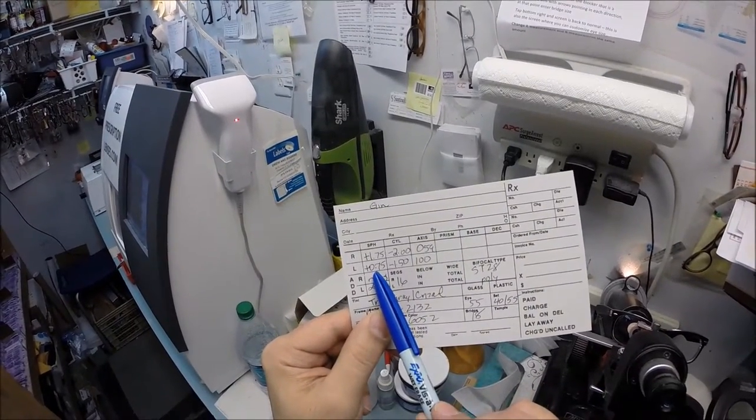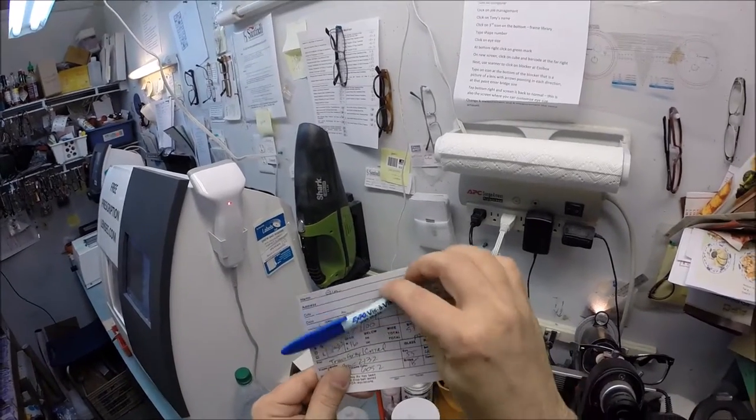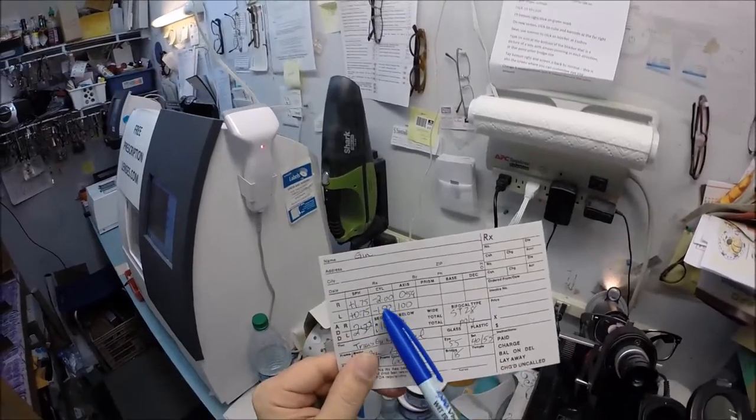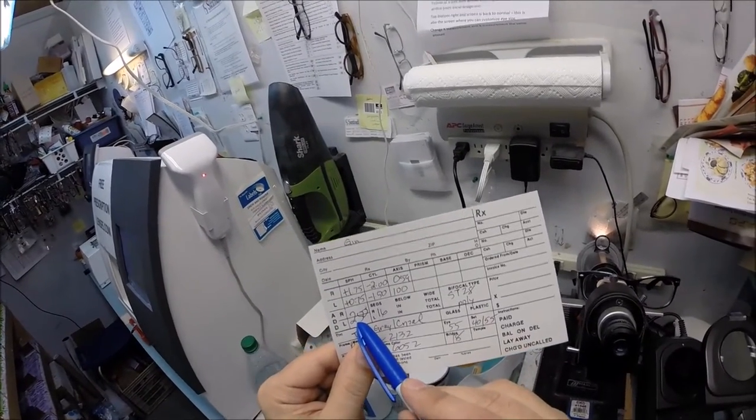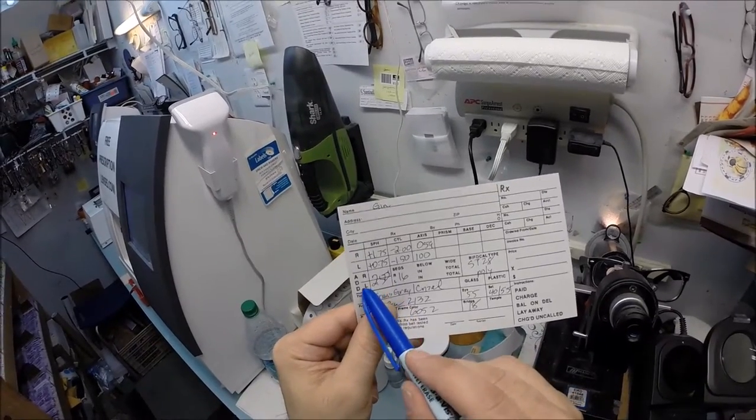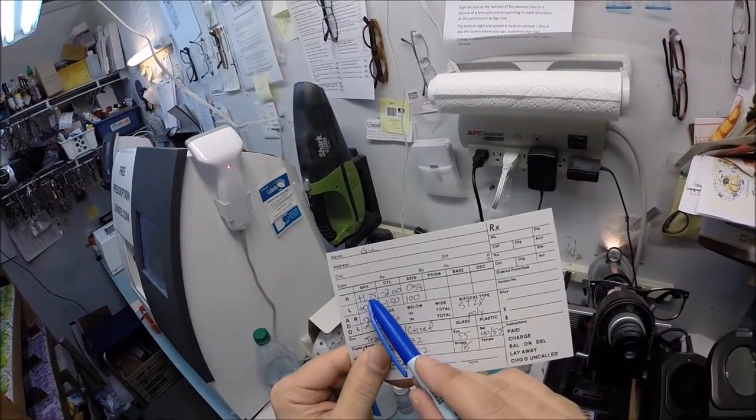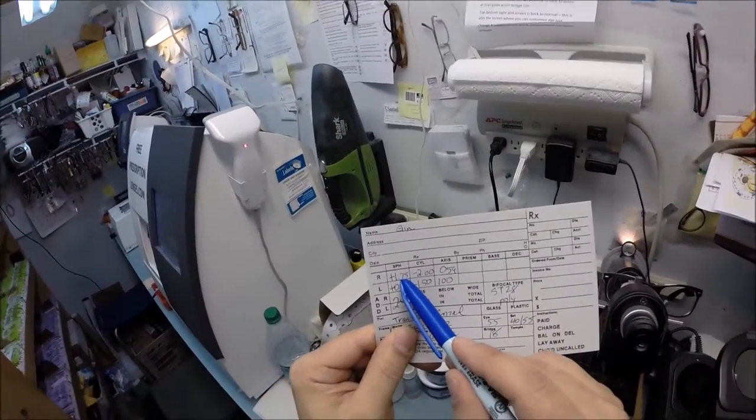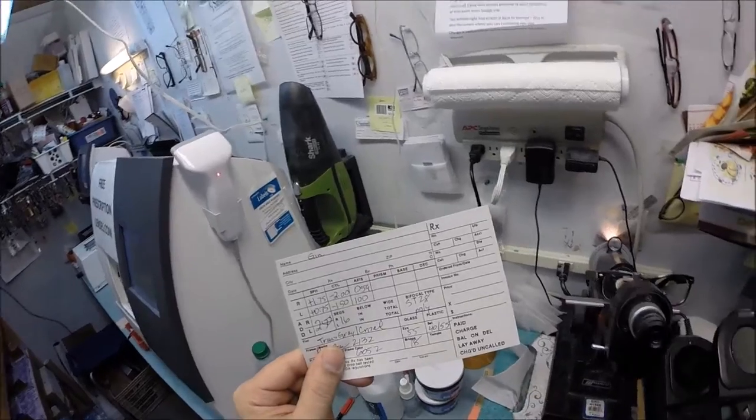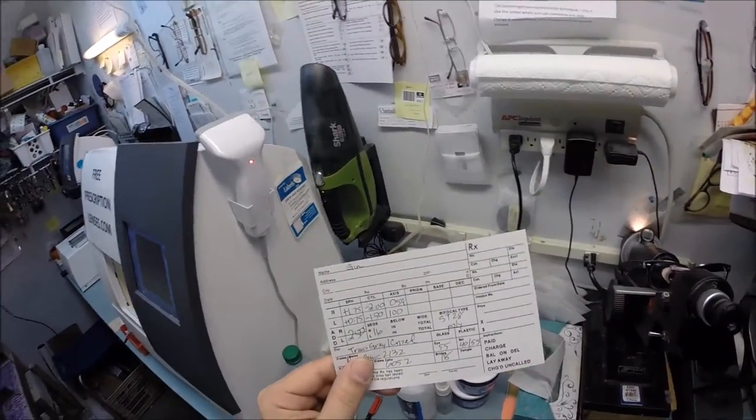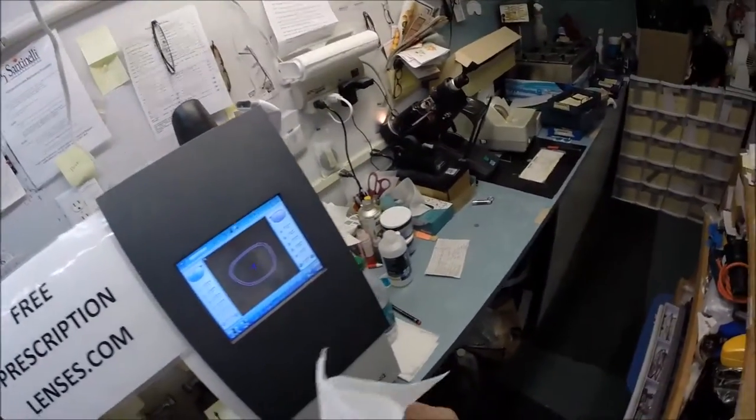Your left eye is a little better. You only need three steps of far-sighted correction, but you still need six steps of astigmatism correction. We're going to turn that fine-tuned knob just past the 90 meridian to about 100. Now your bifocal strength is 2.50. You cannot go into a drugstore and buy plus 2.50 readers. The reason why this is called an add, it means in addition to what's on top. When we add 2.50 to the 1.75 in your right eye, that comes out to four and a quarter. Your left eye plus 75 and 2.50 gives you three and a quarter. None of those are going to correct for your astigmatism correction. If you're going to read for more than 15 or 20 minutes, you're definitely going to do better with astigmatism correction so you don't have to squint.